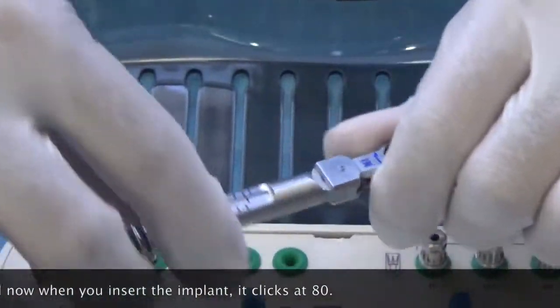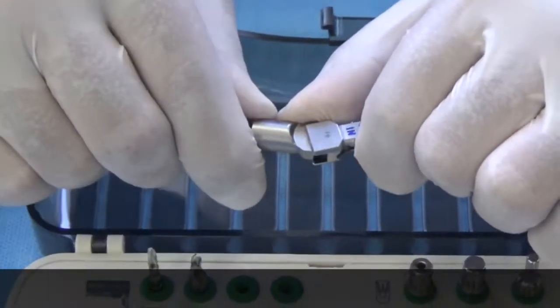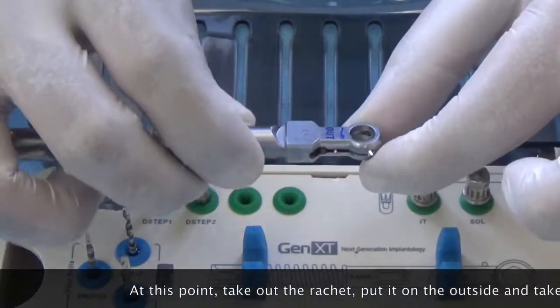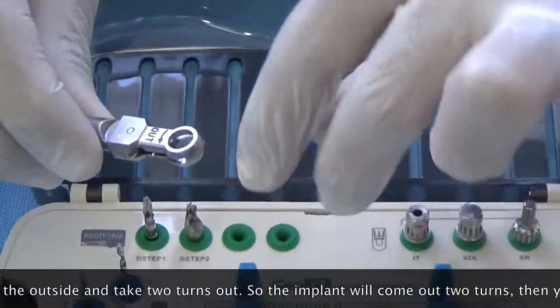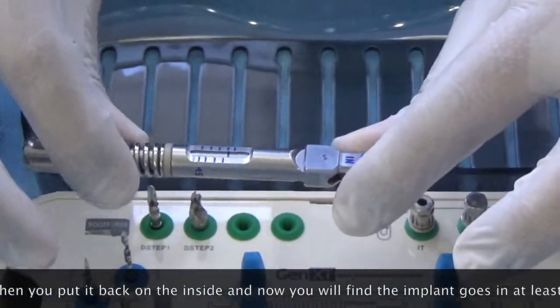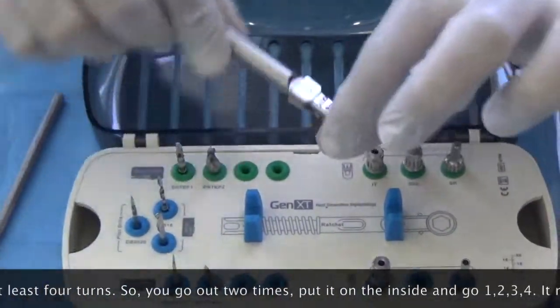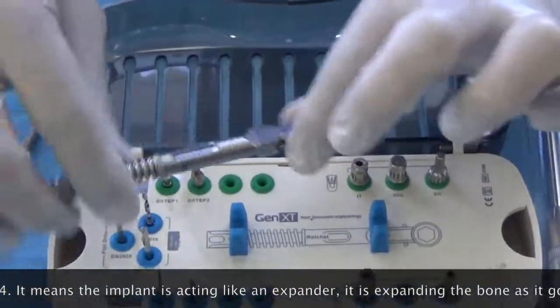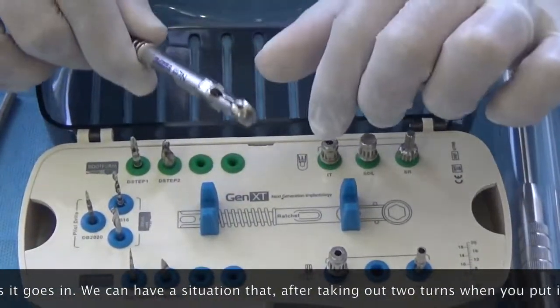I recommend taking the torque up to 80. When inserting the implant and it clicks at 80, it becomes a lot more difficult. At this point, take out the ratchet, put it on 'OUT,' and take two turns out so the implant comes out two turns. Then put it back on 'IN' and you will find the implant goes in at least four turns. This means the implant is now acting like an expander, expanding the bone as it goes in.